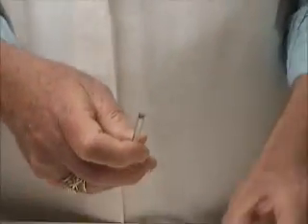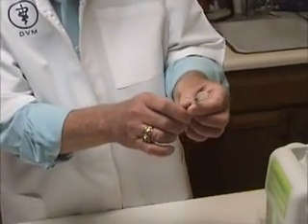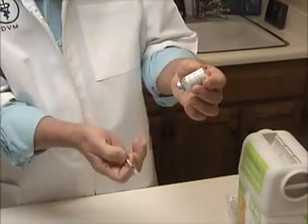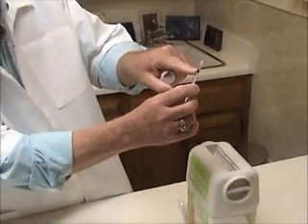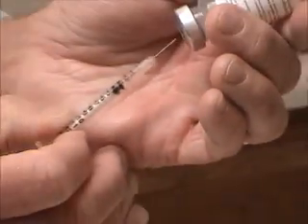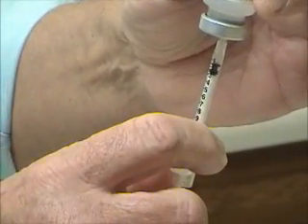What we're going to do is draw out an appropriate amount now that we've mixed it up a little bit. Sweetie has been getting three units of this U40 insulin. We are going to equalize the pressure between the outside air and inside the bottle by injecting three units of air in there, so the pressure will be equal as we withdraw three units of insulin.